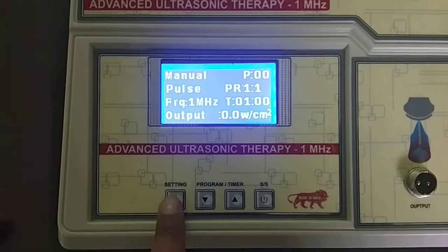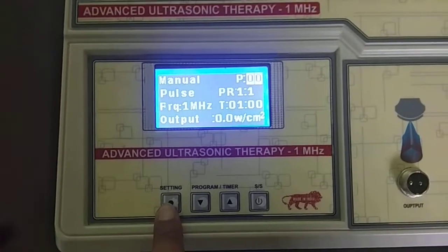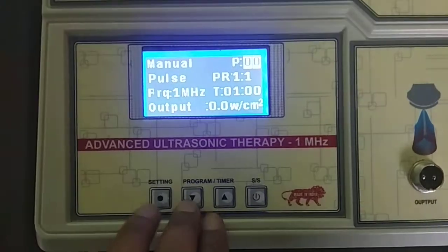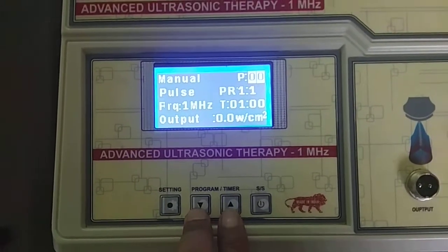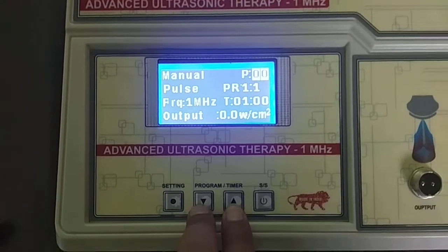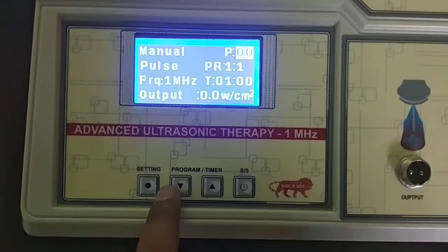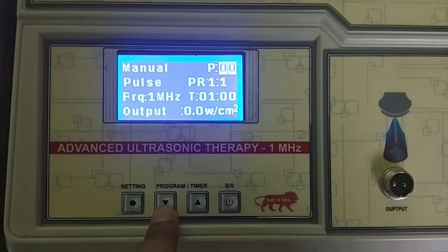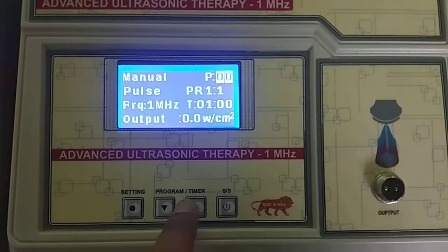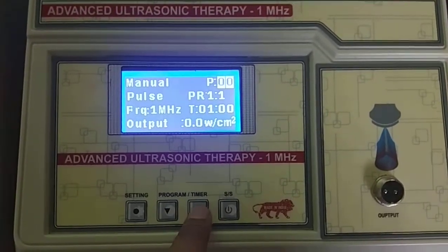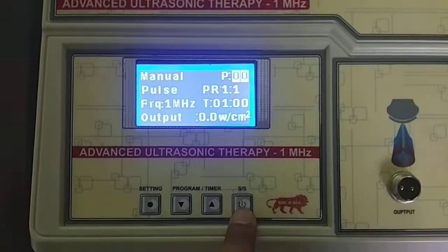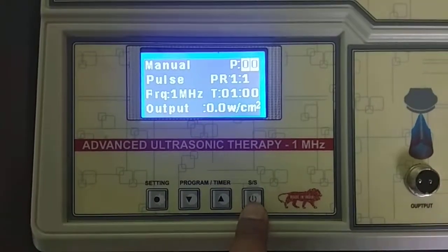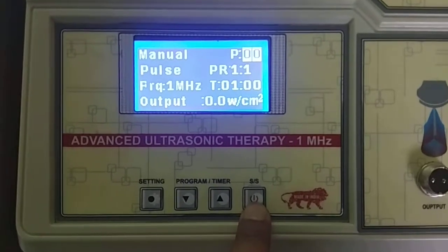This is the Setting key for setting up the programs, this is the Program key for selecting programs, and this is the Timer key. By pressing these two keys you can choose Pulse, Ratio, Frequencies, Output, and Treatment Time. This is the Start or Stop key for starting the programs.